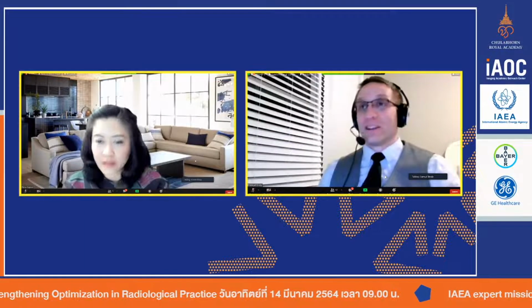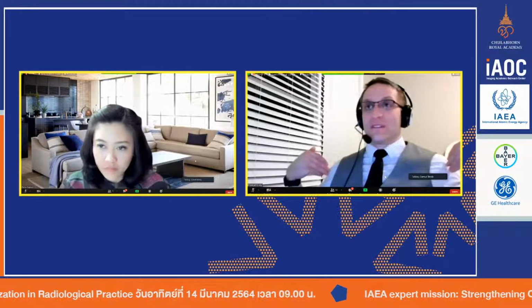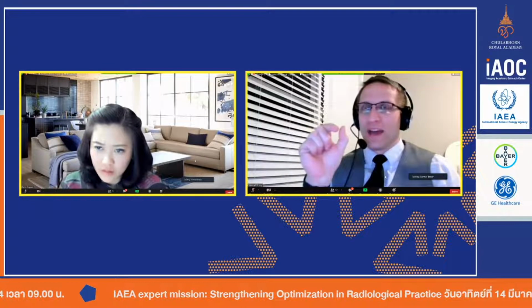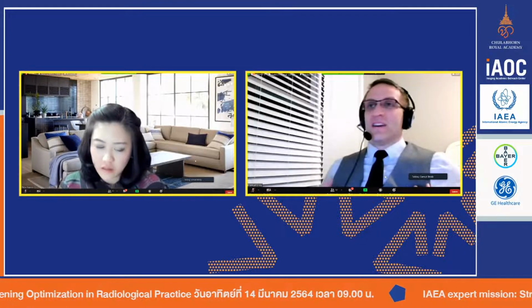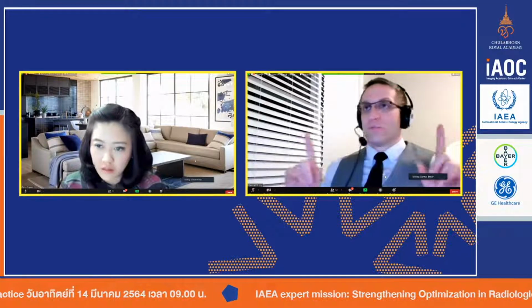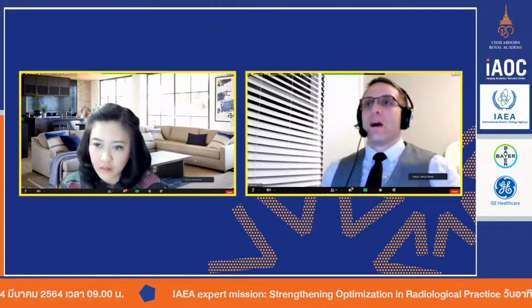It's different than MR. In MRI, you image your field of view, and if you want a different field of view, you have to re-image the body again. But that's MR. Luckily for CT, we always get all of this data, and it just depends on how we display it. If the radiologist says, I want to see something a little different, I want to see more bony anatomy, the technologist can go back and reconstruct using a bone kernel instead of a soft tissue kernel. If it's in the chest, you get the bone kernel and maybe lung kernel and maybe soft tissue kernel. All the same dose, no difference, but different looks of the anatomy.